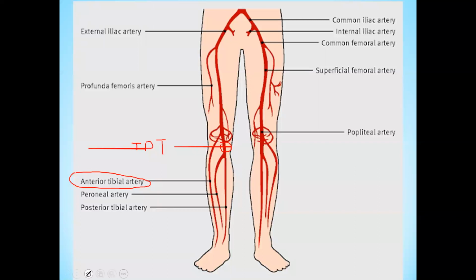As you know, the venous system brings blood back towards the heart from the periphery. That's why you have to describe its anatomy from distal to proximal. So from the distal region, with the posterior tibial vein just posterior to the medial malleolus, you can localize the artery as well as the veins.